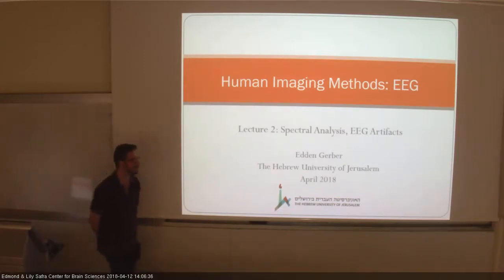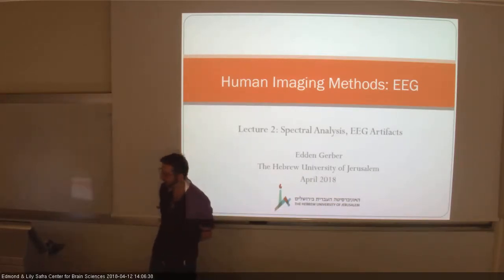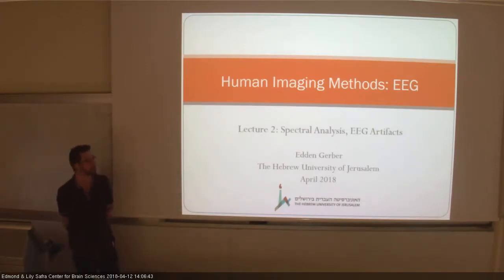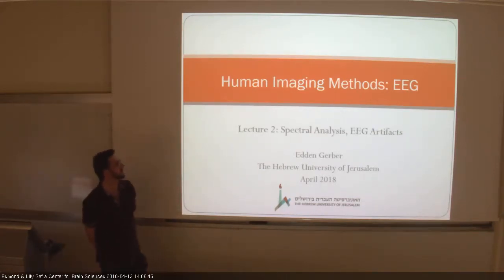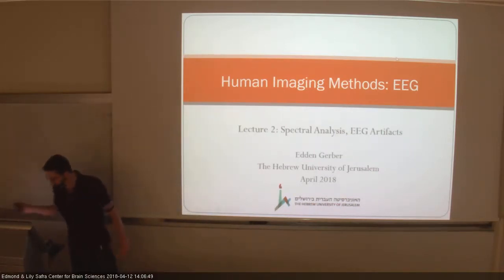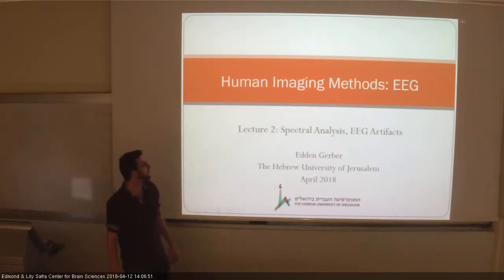So, we're starting our second class about EEG, and today we're going to talk mostly about spectral analysis and then a bit about EEG artifacts. Okay, so let's get into it.